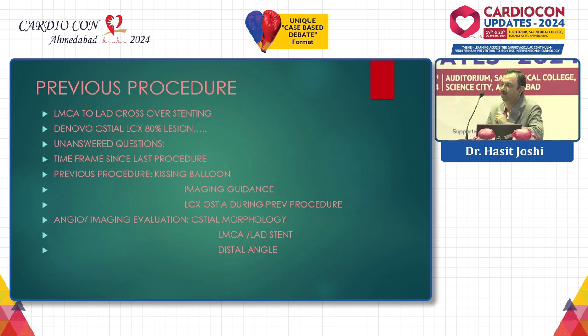What is the ostial morphology? The circ ostium, even without a stent, would be quite fibrocalcific. And ostial circ and distal LMCA always have more fibrocalcific lesions rather than other ones. Now the LMCA-LAD angle and LAD-circ angle, the proximal angle and distal angle, also would modify our treatment.